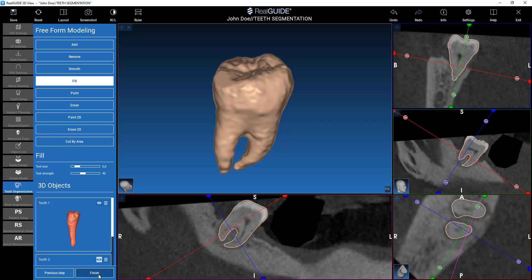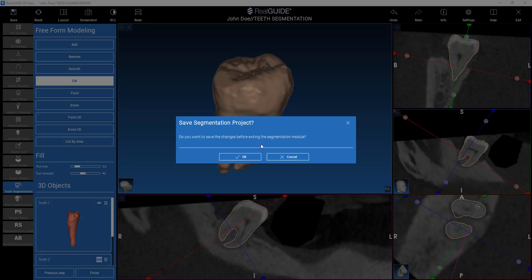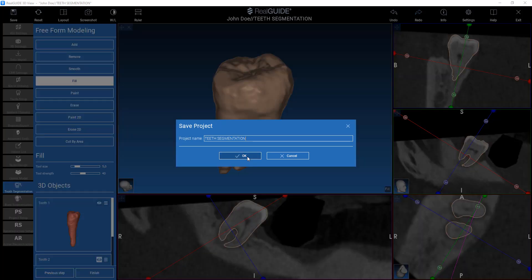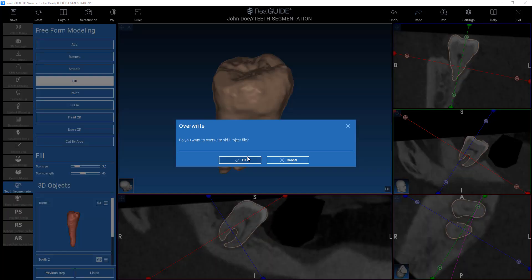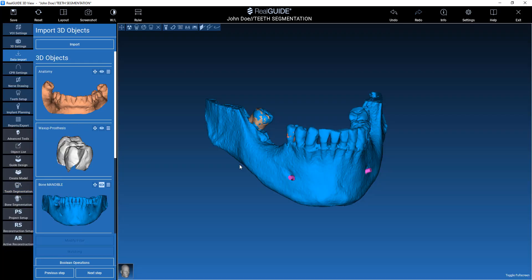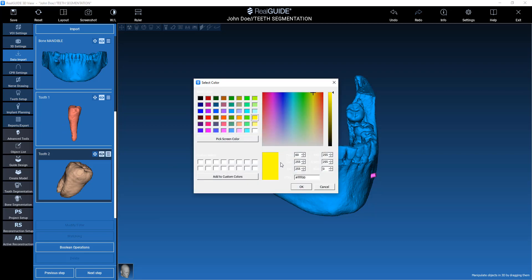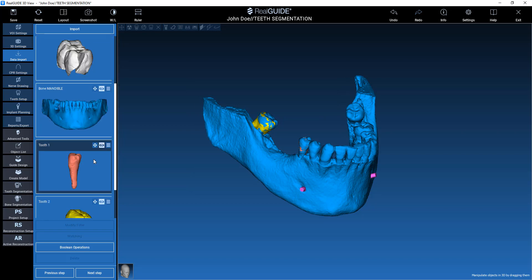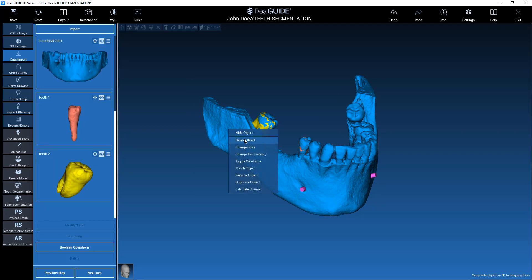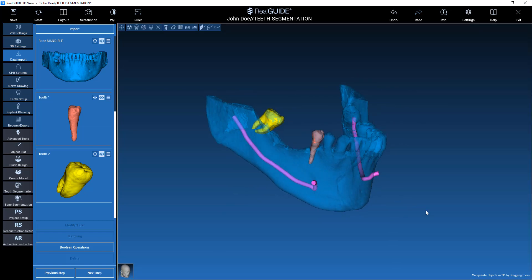When I'm happy, I click on Finish. Clicking on Finish closes the tooth segmentation wizard, so it's better to save before leaving the wizard. Now I can see my new teeth here, so I can change the color, for example. I can see in the transparency of the bone that my teeth have been segmented.